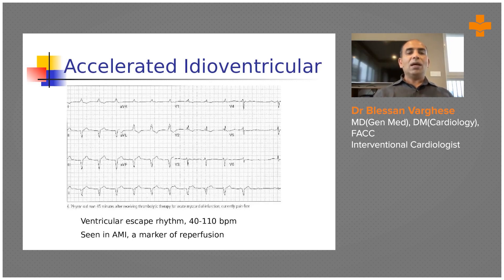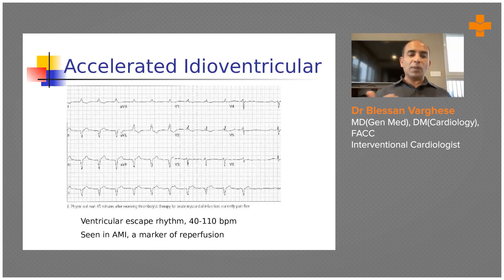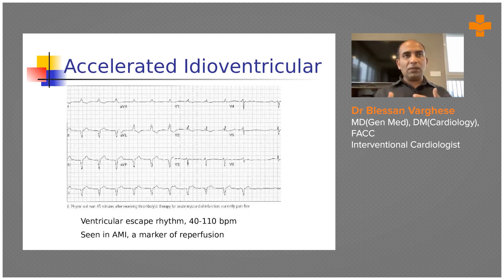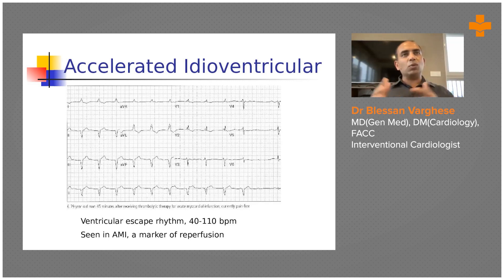This is a ventricular escape rhythm, otherwise called accelerated idioventricular rhythm (AIVR). The rate is between 40 to 110 beats per minute. It looks like a sinus nodal rhythm by rate, but it is not sinus nodal because there is no P wave preceding the QRS complex and the QRS is widened - meaning it originates from the ventricle. The clinical implication is that it is usually a sign of reperfusion in acute myocardial infarction following thrombolysis or primary PCI. You should not confuse it with ventricular tachycardia and should not shock the patient - it is a harmless, good rhythm indicating reperfusion.